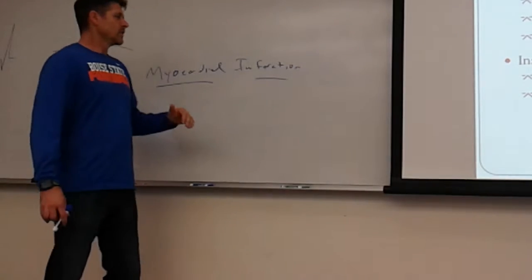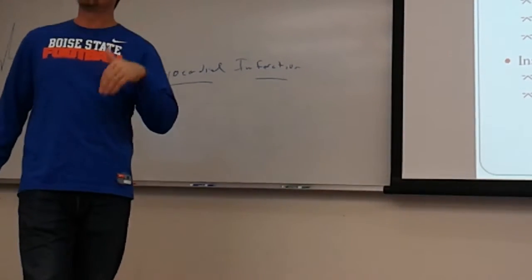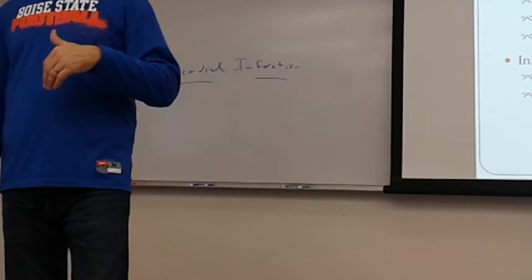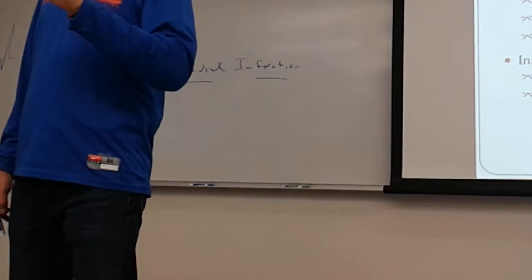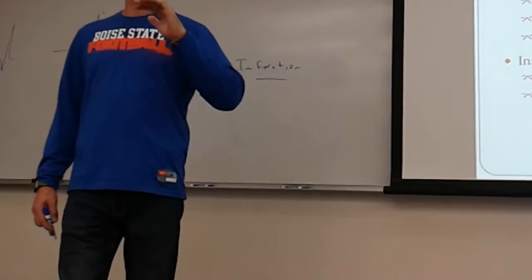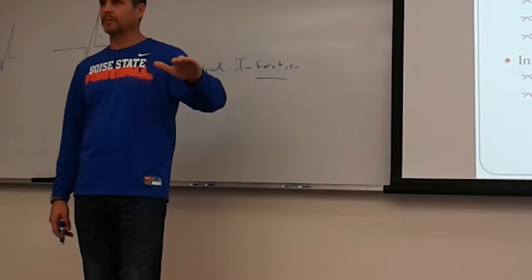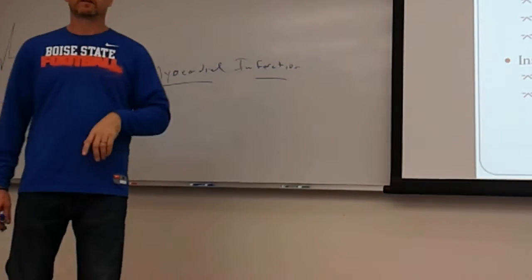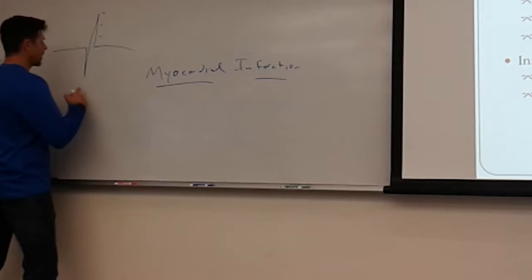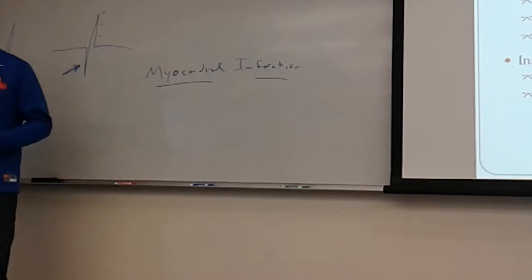Okay. Our ability to tell if somebody is currently having an MI, and therefore their heart is dying but not dead, is related to the ST segment. I'll come back to that later. But if we were to see a pathologic Q wave, then it means that there is a portion of their heart that is dead.